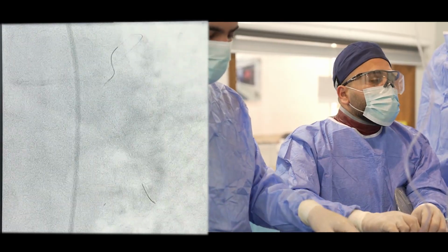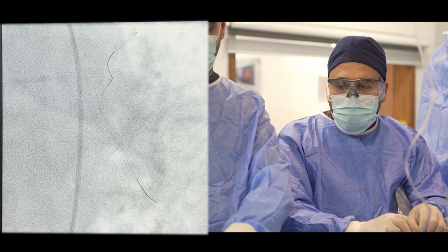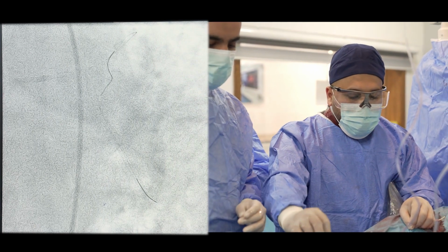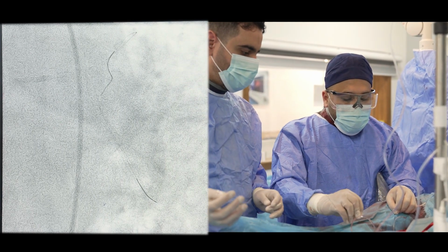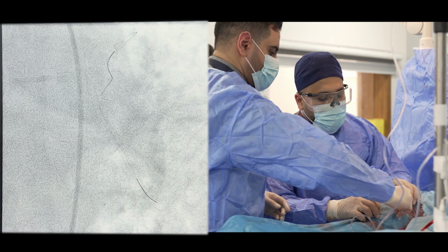Now we take balloon 2.5 for the circ and 5 for the LAD, left main. Open another inflation device. Okay.